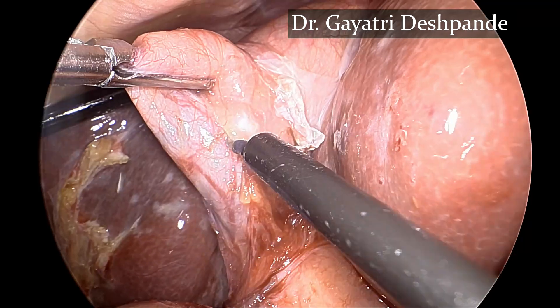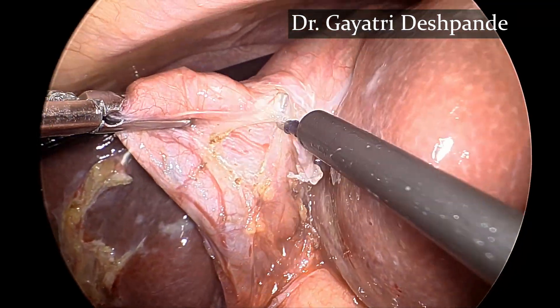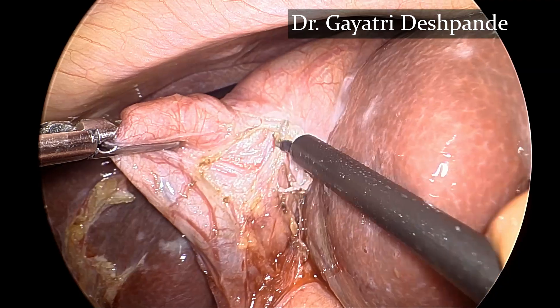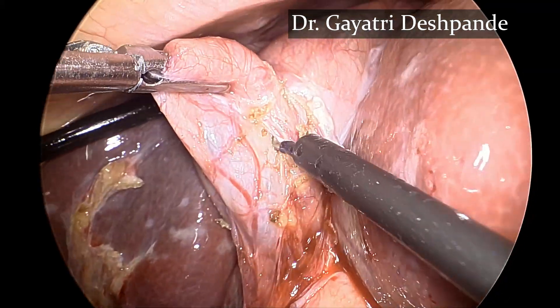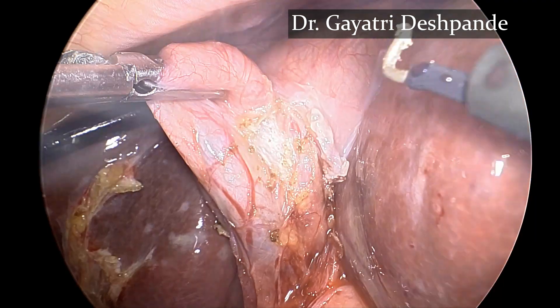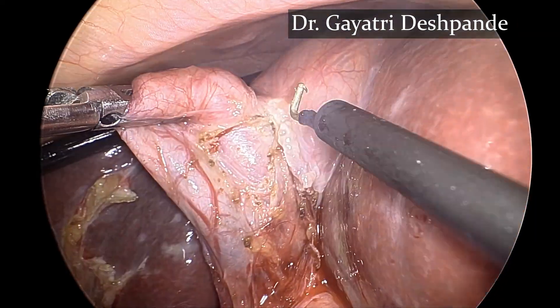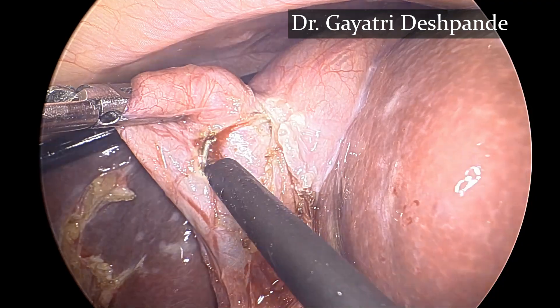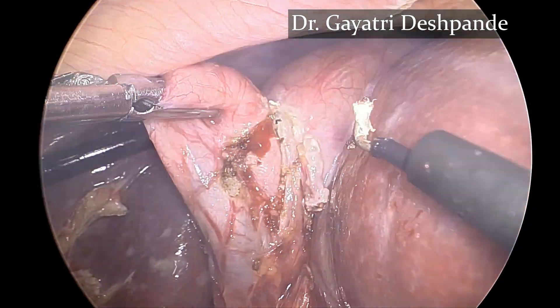Continuous traction with the left hand is very helpful in facilitating a good dissection. The angulation of the hook is helpful in dissection, and short passes of energy are given to prevent bleeding.